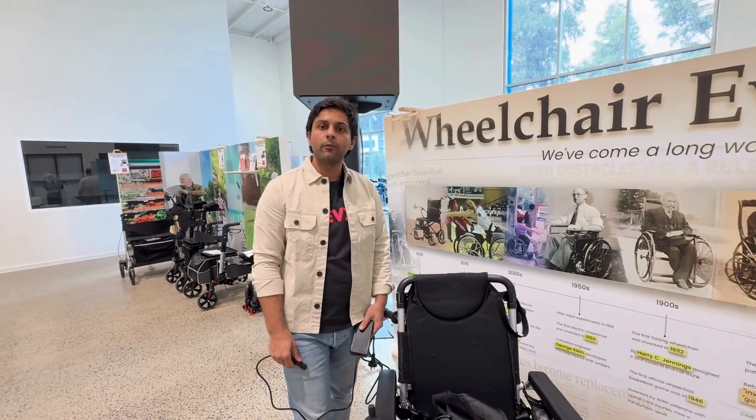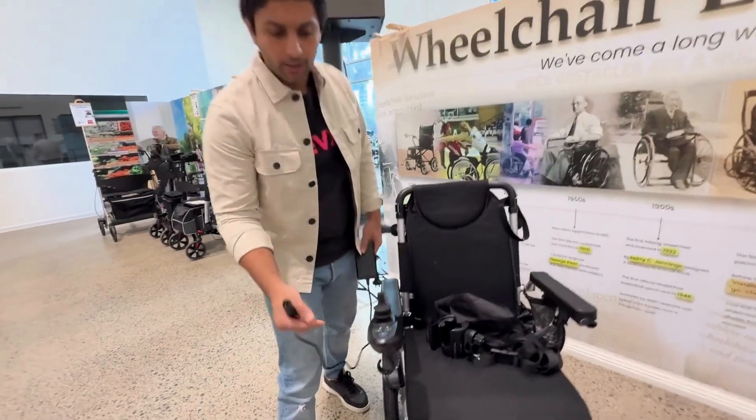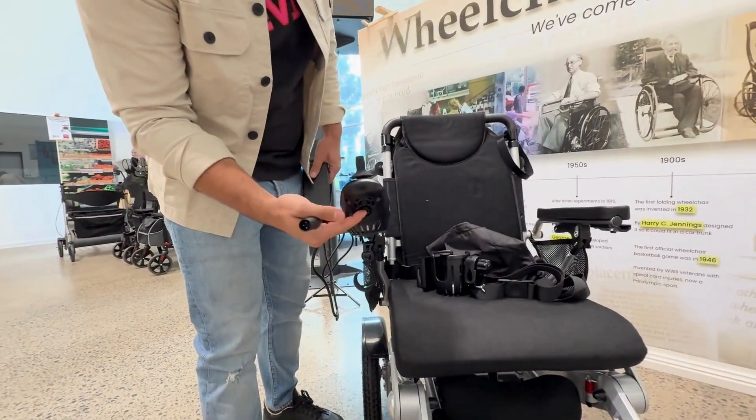This wheelchair can go up to 15 km on a single charge. To charge this wheelchair, simply plug this into the charging point located under the controller.